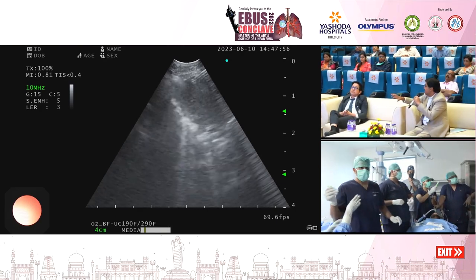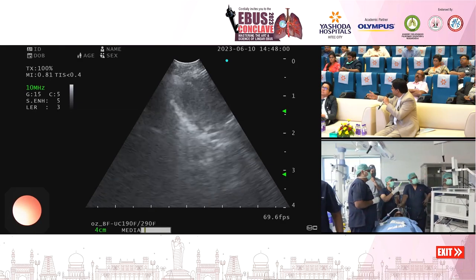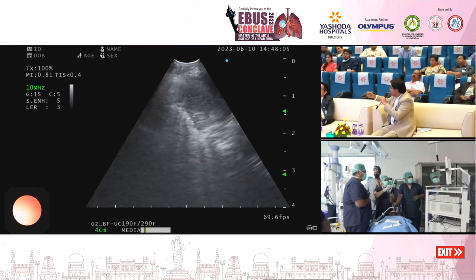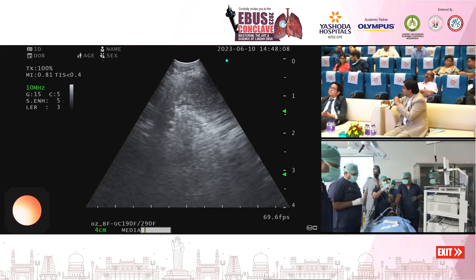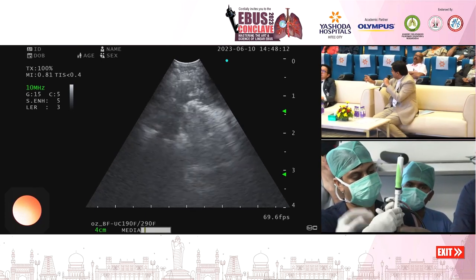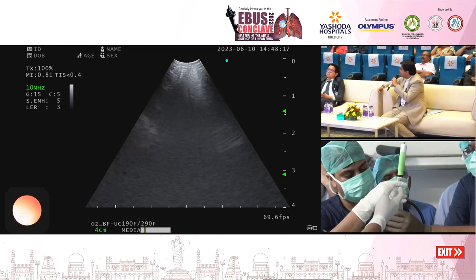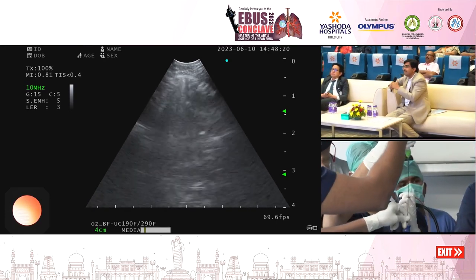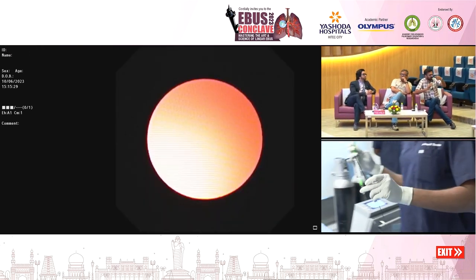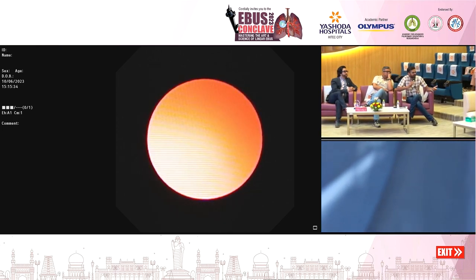Sometimes it is said that in a malignant node, the central part becomes a little more necrotic and tends to have fewer cells. So if you try to go to the periphery, you might actually have a better yield for malignancy. Going to the periphery is not wrong, but as Dr. Valiappan has rightly said, you should be careful that you don't go across the node, and you should be careful when you do the revolutions. The other thing is that operators rotate the wrist and sample at a different angulation, aiming to target a different area, but how much it adds to the yield is not clear.